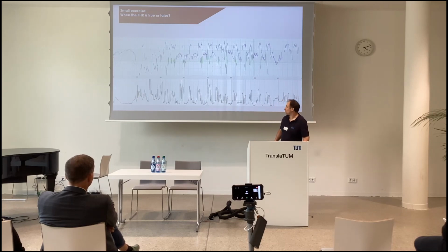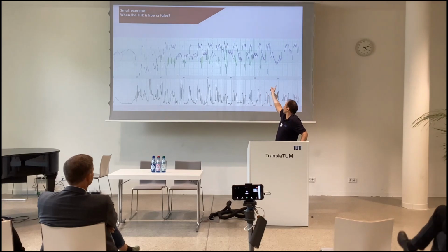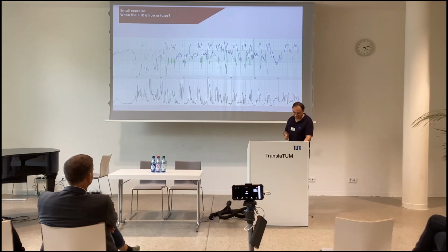So if you don't believe me or Antonia, this is a particular recording because we have the scalp ECG which was recorded at the same time, so we can see where the true FHR is.